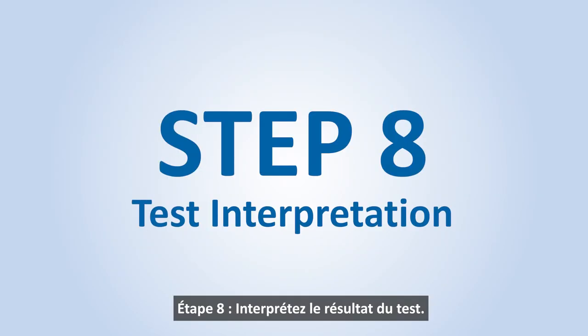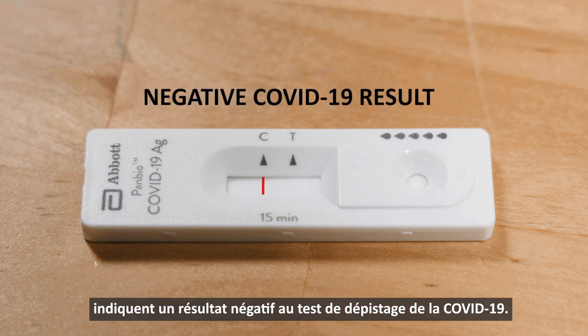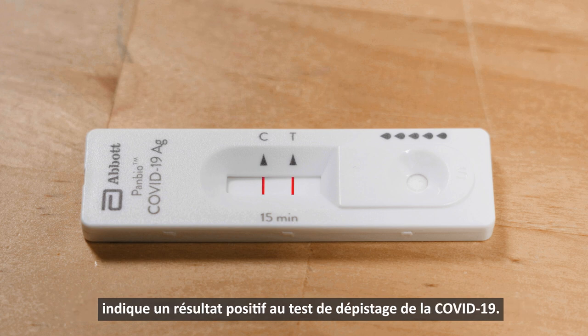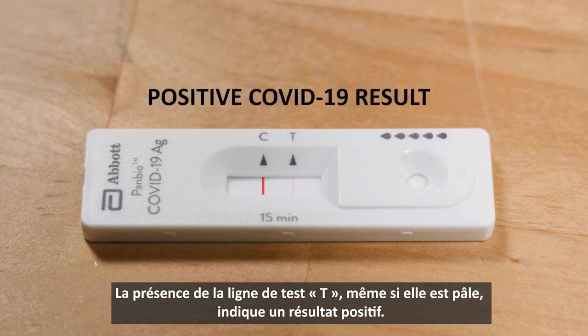Step 8. Test interpretation. The presence of only the control line marked C and no test line marked T indicates a negative COVID-19 result. The presence of both the test line T and the control line C indicates a positive COVID-19 result. The presence of any test line marked T, no matter how faint, indicates a positive result.